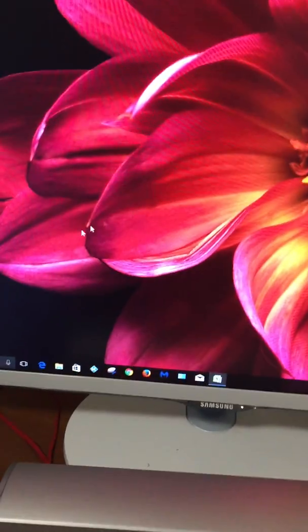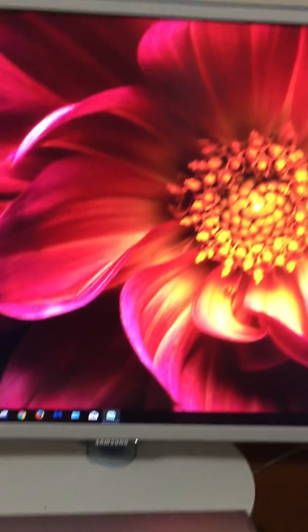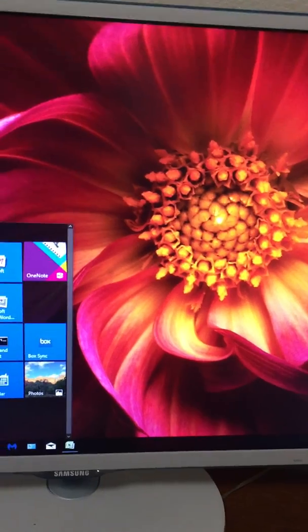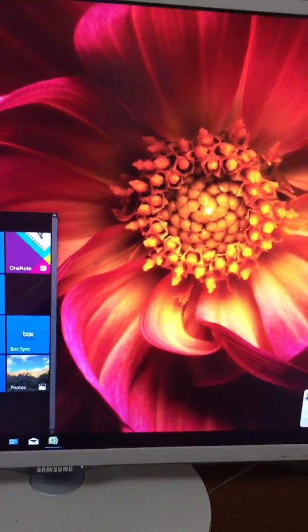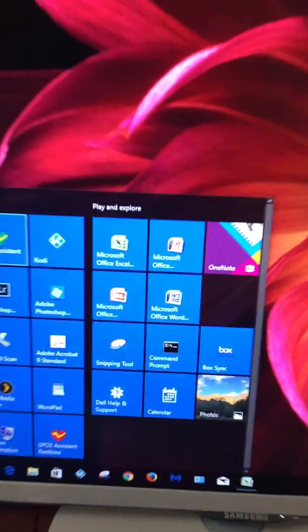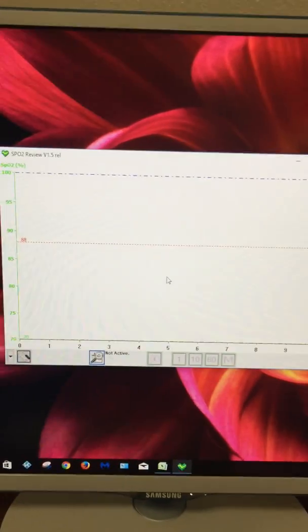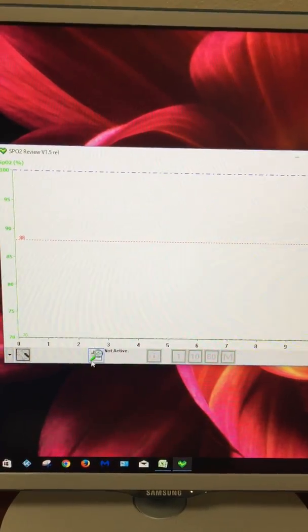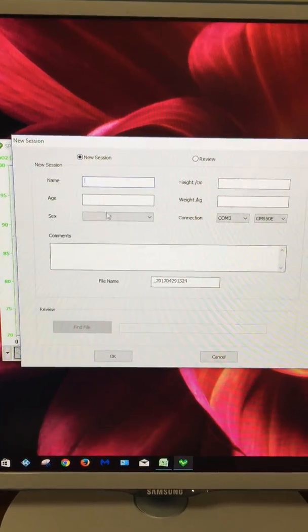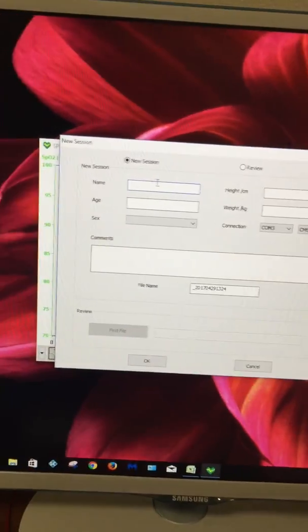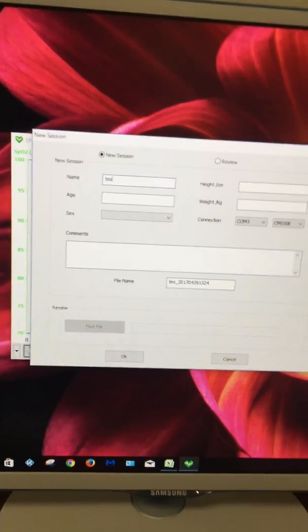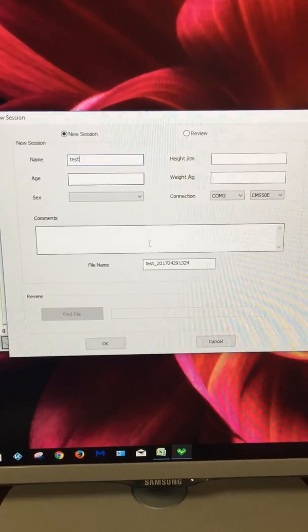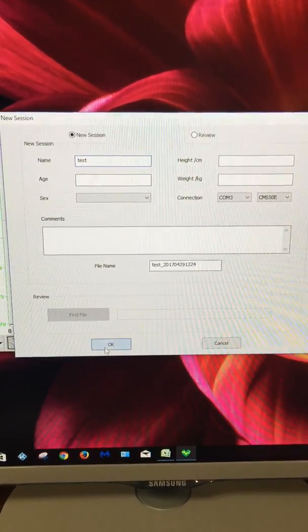First, go to the program SPO2 Assistant Reader. Load that, turn that on. Then say new session, give it a name. Test. You say okay.